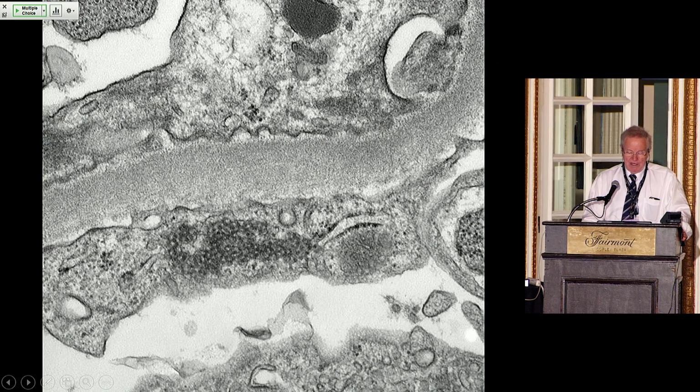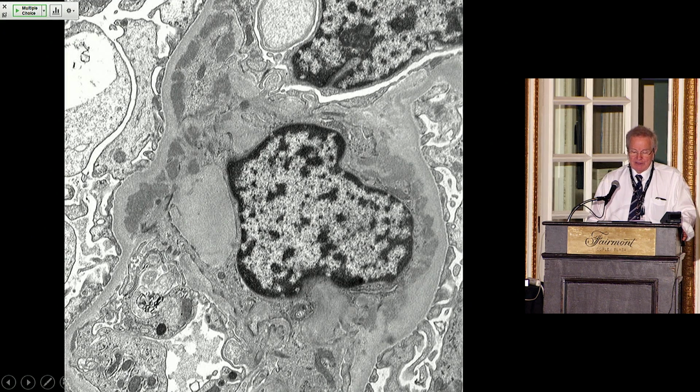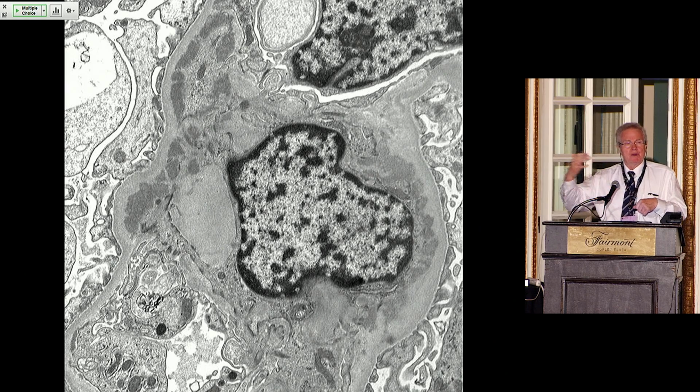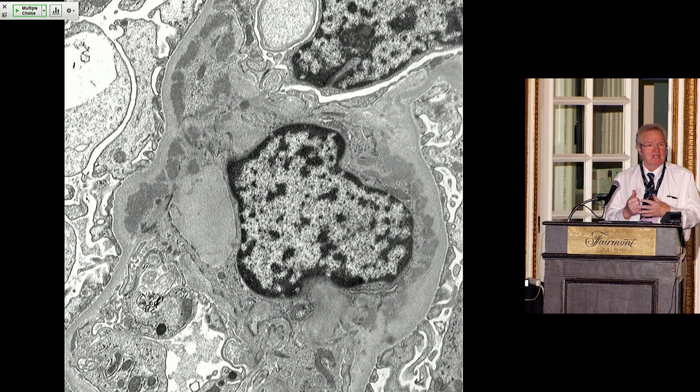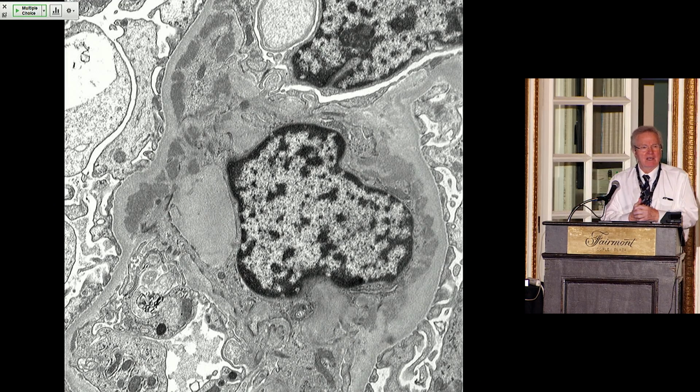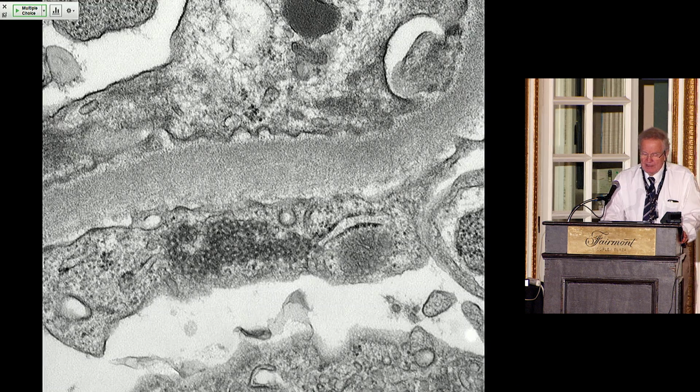This patient with lupus then also has tubuloreticular inclusions and relatively few deposits. In this case, deposits only limited to the mesangium. So patients with lupus, like this class 2 lupus, underlying the disease, can develop a superimposed podocyte disease, minimal change disease. They develop another antibody that is responsible for the added pathophysiology. In this case, the patient probably developed yet another antibody that has triggered this crescentic form of injury.